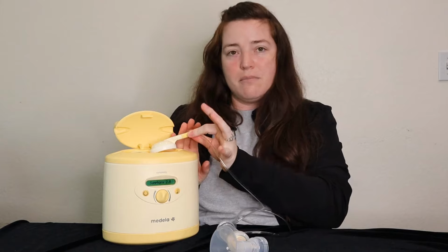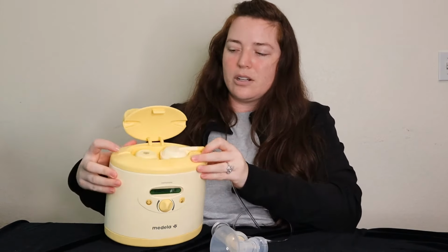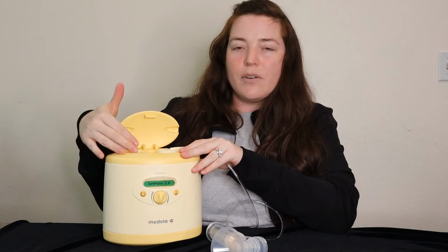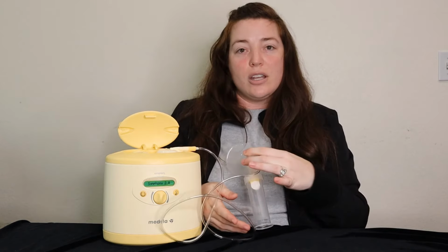And I'm going to put my membrane part on nice and tight. The tubing goes off to the side. There's a little bit of an indent so you can see. And I'm going to push it down. Make sure it's good and tight, and you can close the door or you can leave it open. I'm going to leave it open so I can go ahead and show you what it looks like when it's working. And I'm going to put my flange on and start pumping.